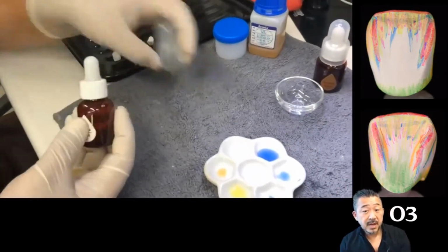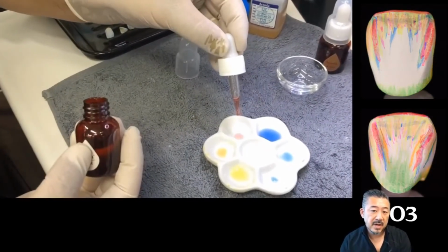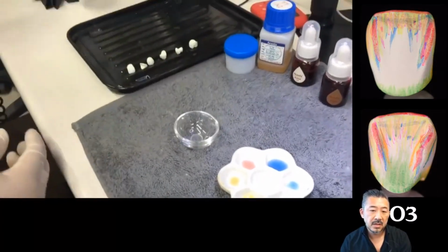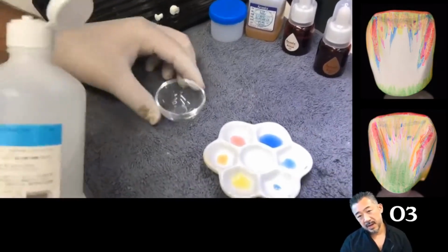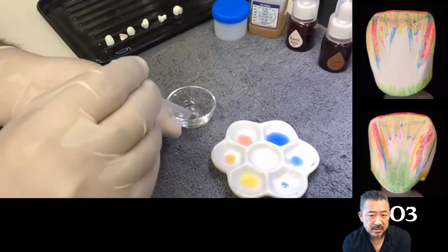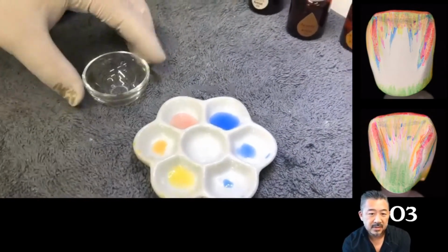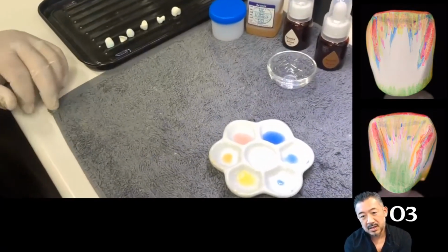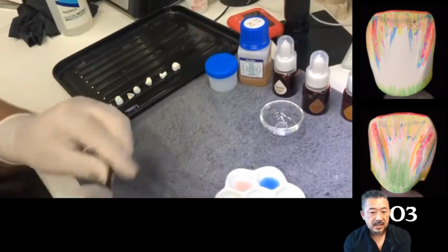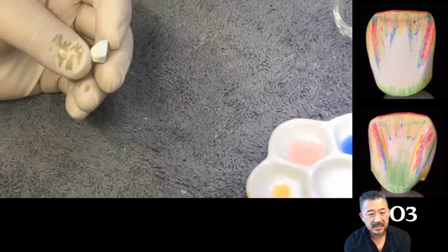At the last, use O3 vanilla. The screen on the right is purple. It can be applied to the incisal edge and the marginal ridges, or used to reproduce a labial white band. However, this O3 vanilla is so strong, I mixed it with purified water. The ratio should be 1:1 or a little more purified water. It is so emphasized, you need to be very, very careful when using it.